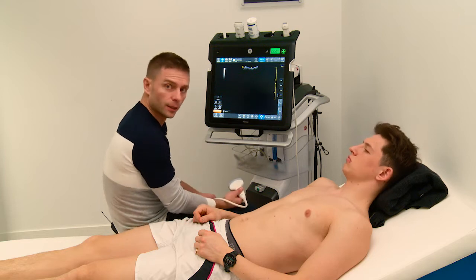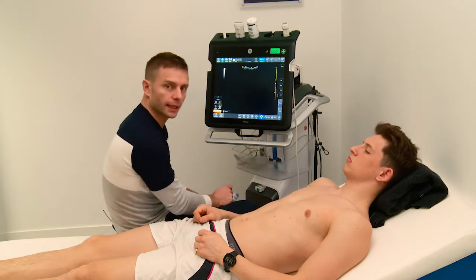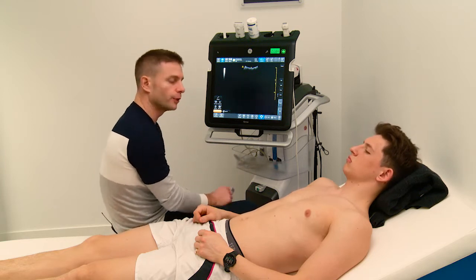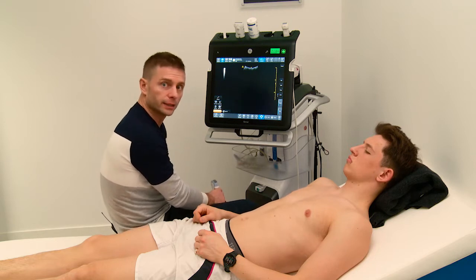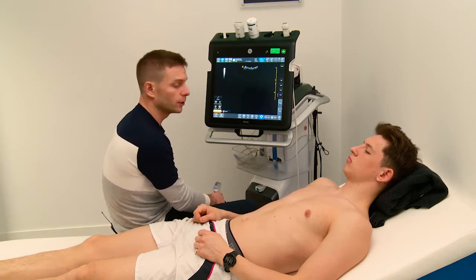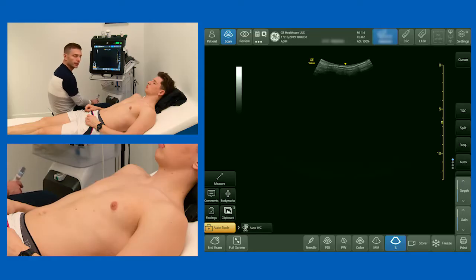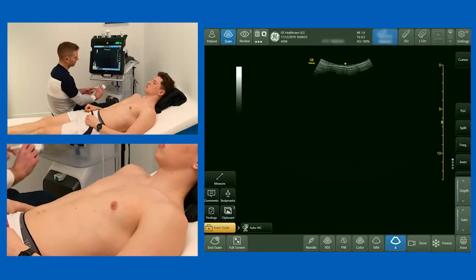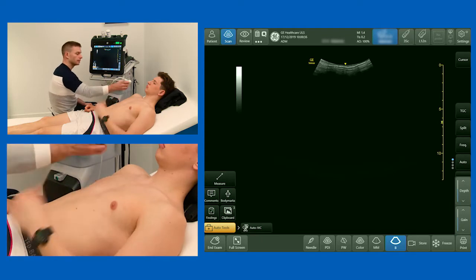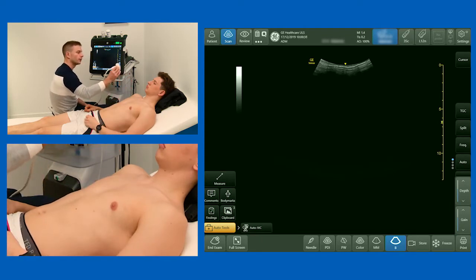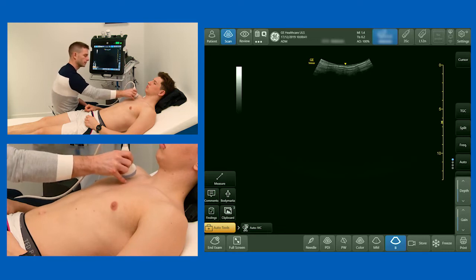We need to know where to place our probe, and we're going to do an exam using three points on each side of the chest: the upper anterior, the lower anterior, and the posterolateral point. The upper anterior point is midclavicular line, second or third intercostal space, and we put our probe longitudinally, cephalad to caudad.